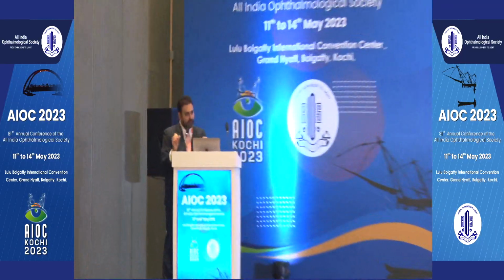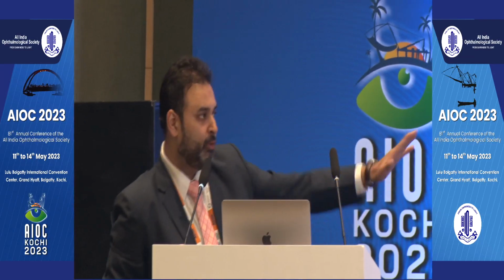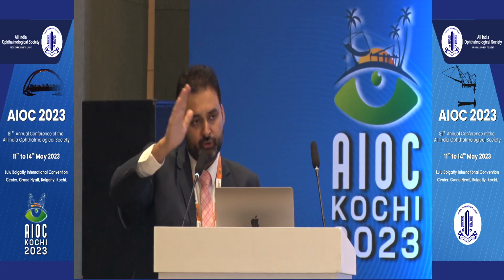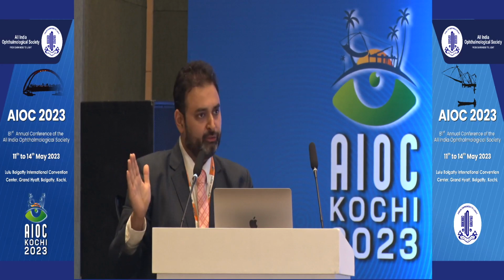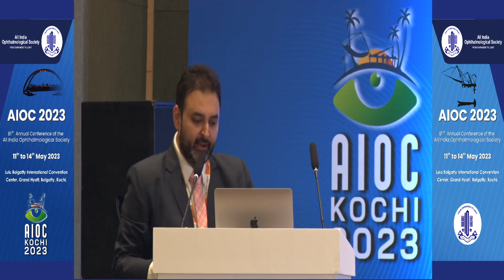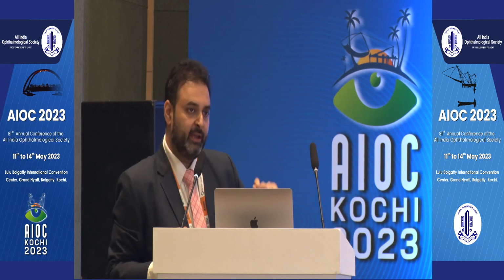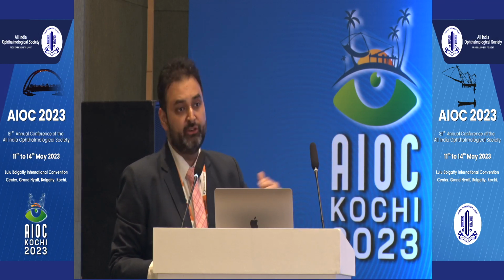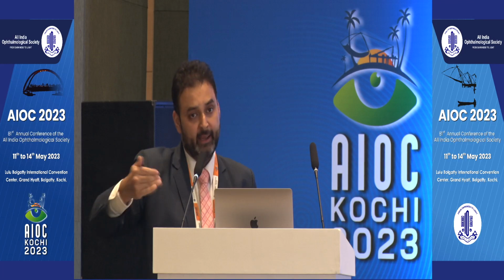Whereas if it's an infusion cannula related issue, I think the site is very important. Both these patients, you saw that it happened in the quadrant of the infusion cannula. So there was a localized choroidal detachment in the inferotemporal quadrant where you have the infusion cannula. It can either be partly out, as was in the second case, or be inside, but with the infusion line actually running dry and you not knowing.